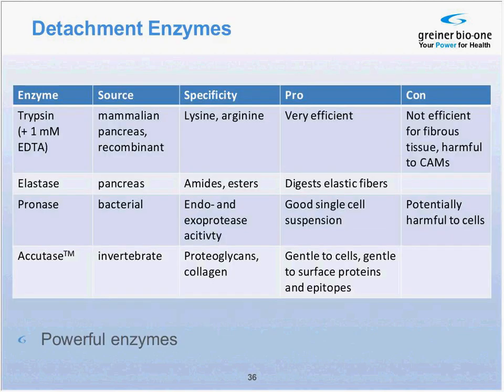Trypsin is the most common detachment enzyme as it is very efficient and comes as a ready-to-use solution. It is available both as a purified and a recombinant enzyme, and there are combinations of trypsin with EDTA available. EDTA chelates divalent ions. At higher concentrations, a drawback of trypsin is the cleavage of cell adhesion molecules that might be subject to further investigations. In this case, Accutase, for example, might be a better option as it is more gentle to cell surface proteins.